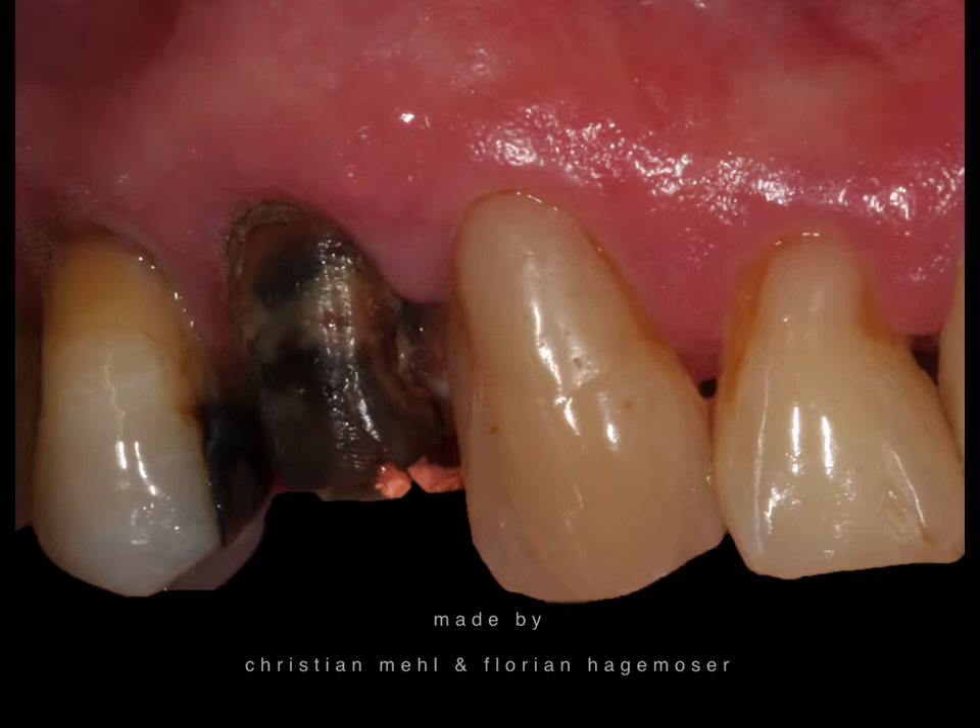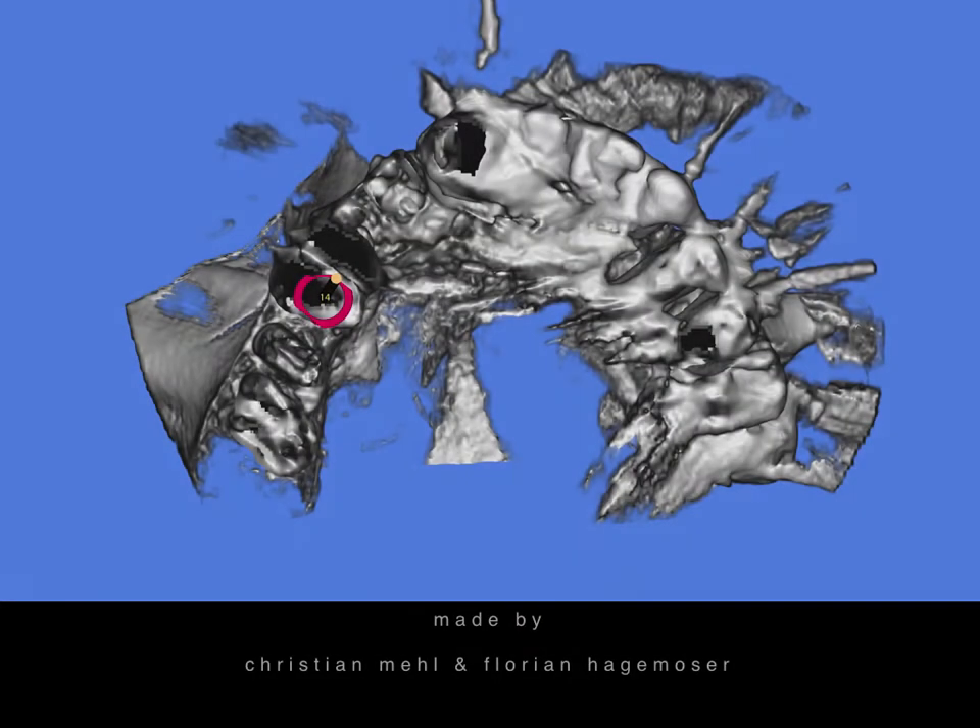We decided it would be best to take the tooth out and place an implant straight away. To reduce the discomfort and number of appointments for the patient as much as possible, we decided to place a guided implant and immediately restore it with a pre-manufactured temporary. That is the interesting part of this small presentation.